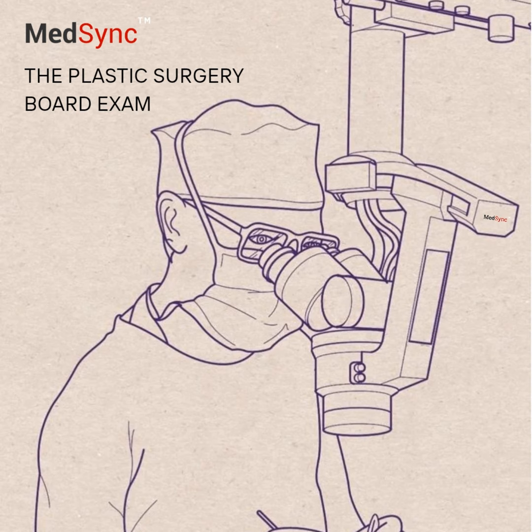How does it compare to chemical peels? Effects can be similar to a medium depth or even deep peel like phenol, depending on the laser and settings. An advantage is often less effect on pigment cells compared to deep peels, so potentially less risk of permanent hypopigmentation. Melanocyte function is often retained.